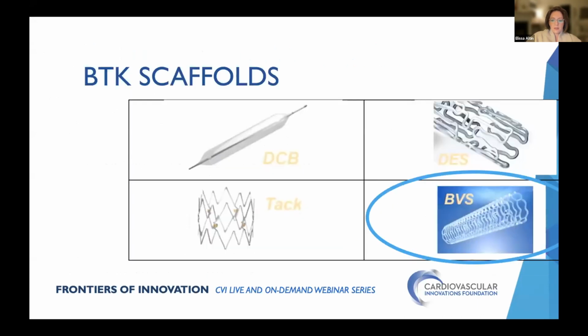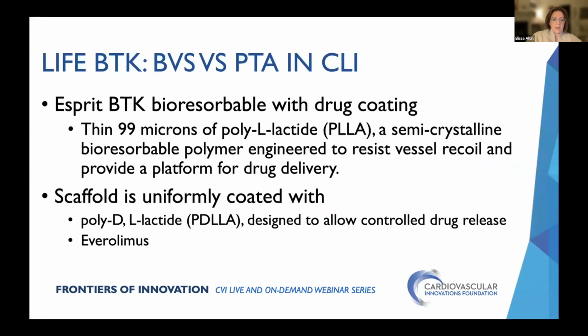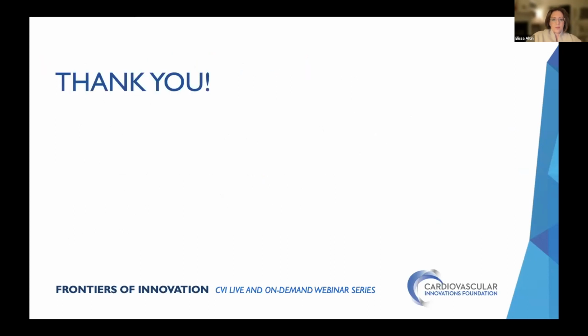And then finally, the bioabsorbable scaffold. The LIFE BTK study is upcoming, looking at the Esprit bioresorbable stent with a drug coating. It's everolimus drug with a PDLLA coating for controlled, sustained drug release. So although we may not have current options for drug-eluting therapies below the knee, hopefully they will be coming. Thanks very much.